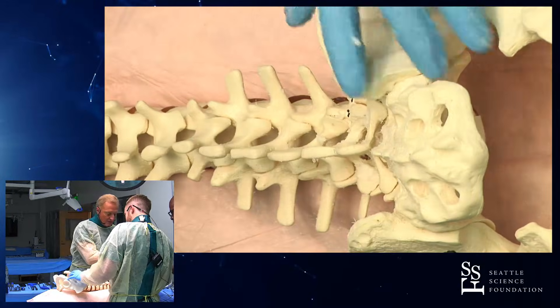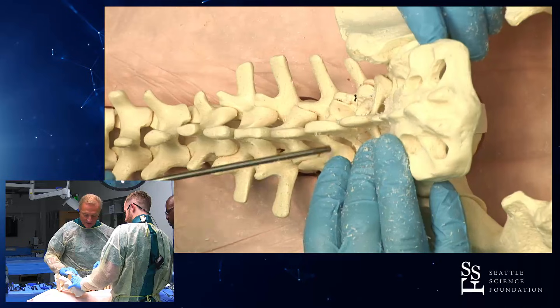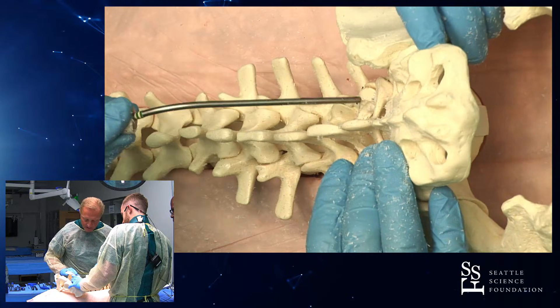And so we will now, again, we do this under steady irrigation so that the high-speed burr doesn't get gummed up.